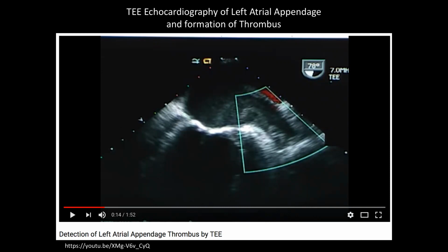So we can talk about what is our spatial resolution, what is our time resolution, contrast, all that kind of stuff. It boils down to how the physician is going to call it. Their dial changes a lot when there's something on the line, right? So if they look at it, they're really careful. They're calling it negative, that it truly is negative.